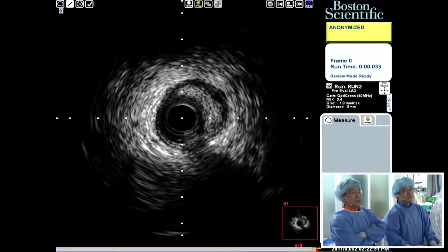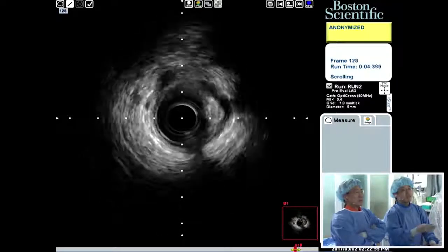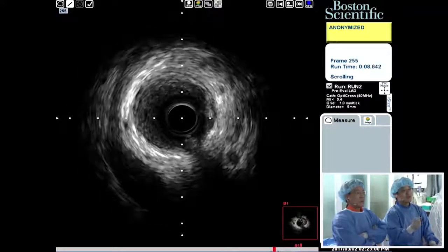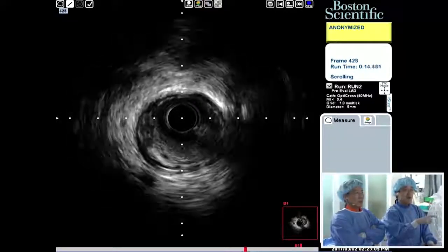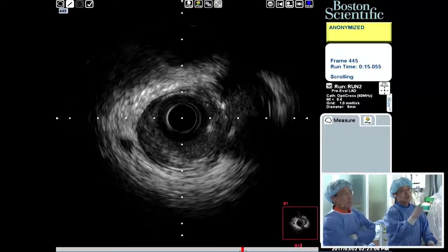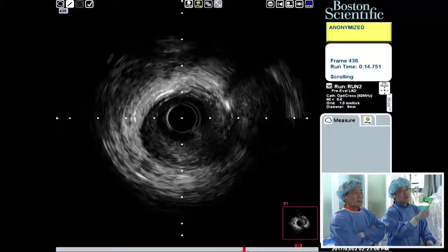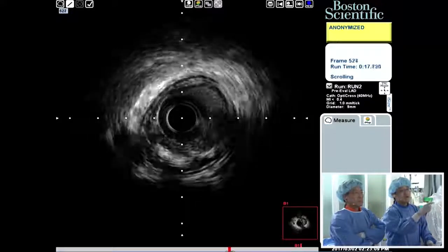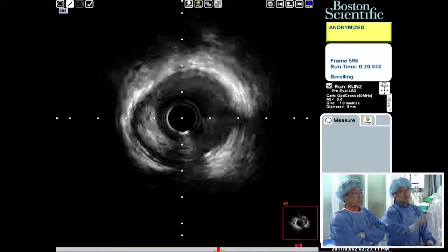LAD from the distal? Yes, and we also checked the LAD. That portion was the distal part of the diagonal branch, and the vessel size was not so big, 2.75. And this is just the lower, distal part of the diagonal branch. Look at the diagonal branch coming from the 3 o'clock; in that area the vessel size was just 3.0, and at the diagonal branch ostium there is some larger plaque. This is the proximal part of the LAD, and the vessel size is more than 3.0.